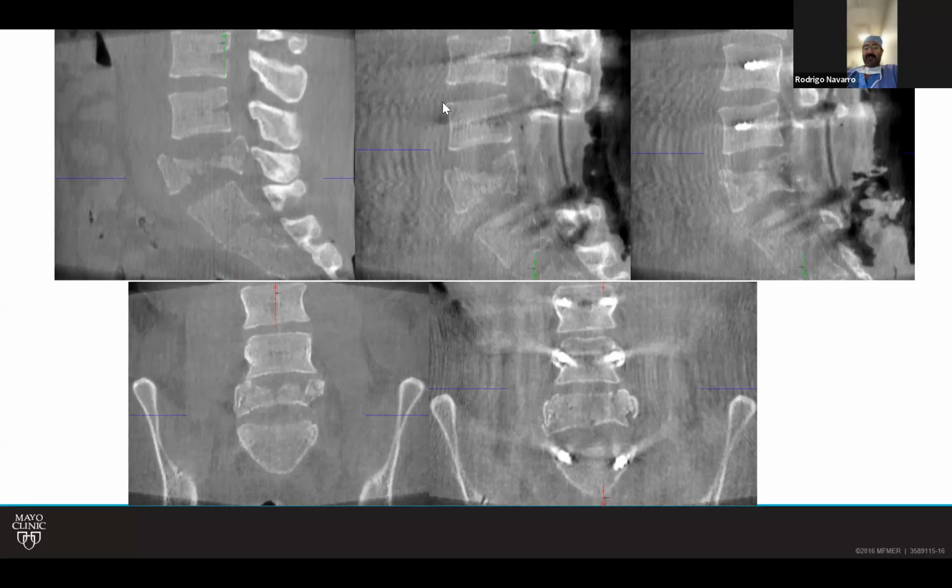The short segment up below, I would have probably anchored in the iliac or S2 iliac, because you know those screws at S1, unless you go bicortical, could be stronger. But other than that, they are considered weak screws.